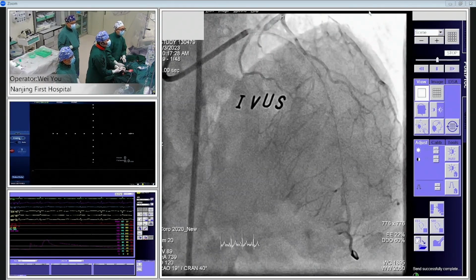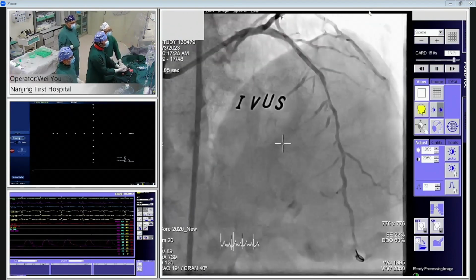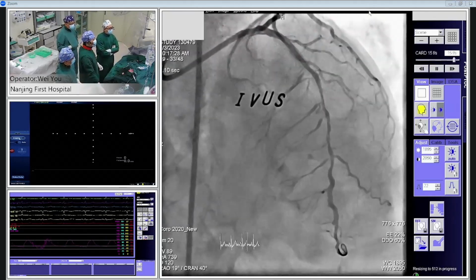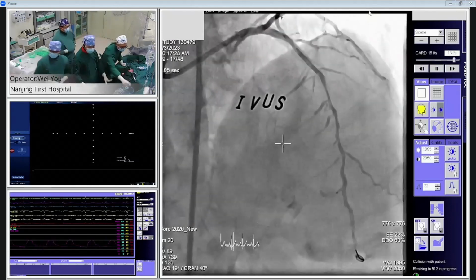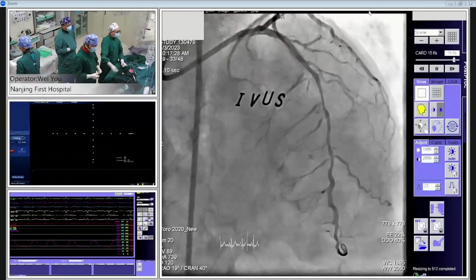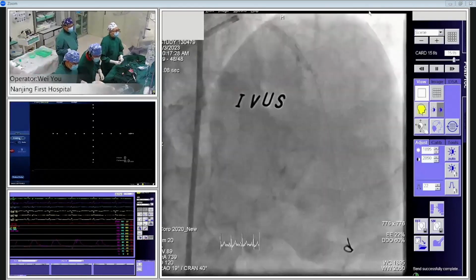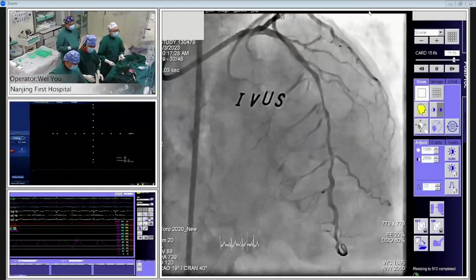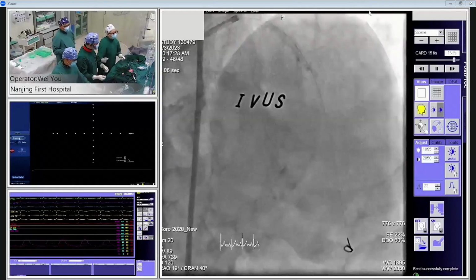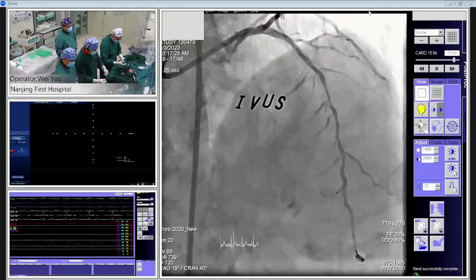It's a large spasm. So, Chief, for the distal segment, we need the NC balloon to prepare the lesion. Sure. Give me a 2.5 NC balloon. The proximal lesion preparation after rotablation and IVL is quite good. Before that, do we need to recheck IVUS? I think after the balloon pre-dilation, we can check the IVUS before we put the stent.